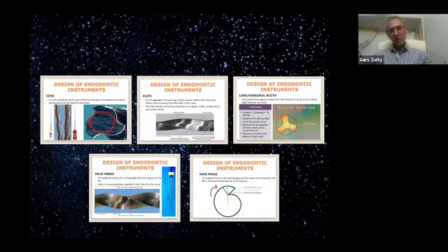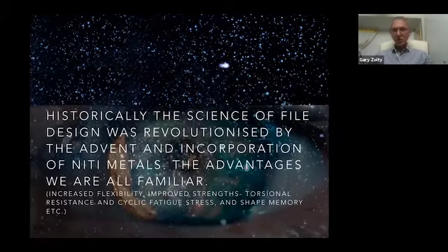You'll see that, and if we compare them, we'll see that things are changed between the different systems. And through these changes, they're going to give different properties of the filing. And in that way, they might be more efficient. So it's worth having a look at carefully.